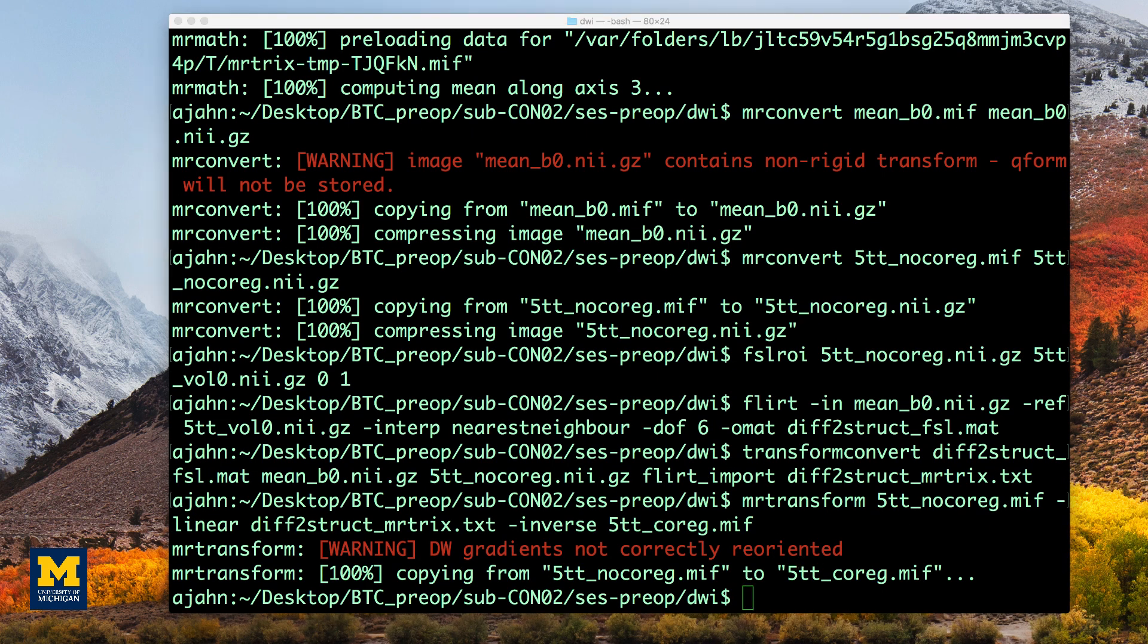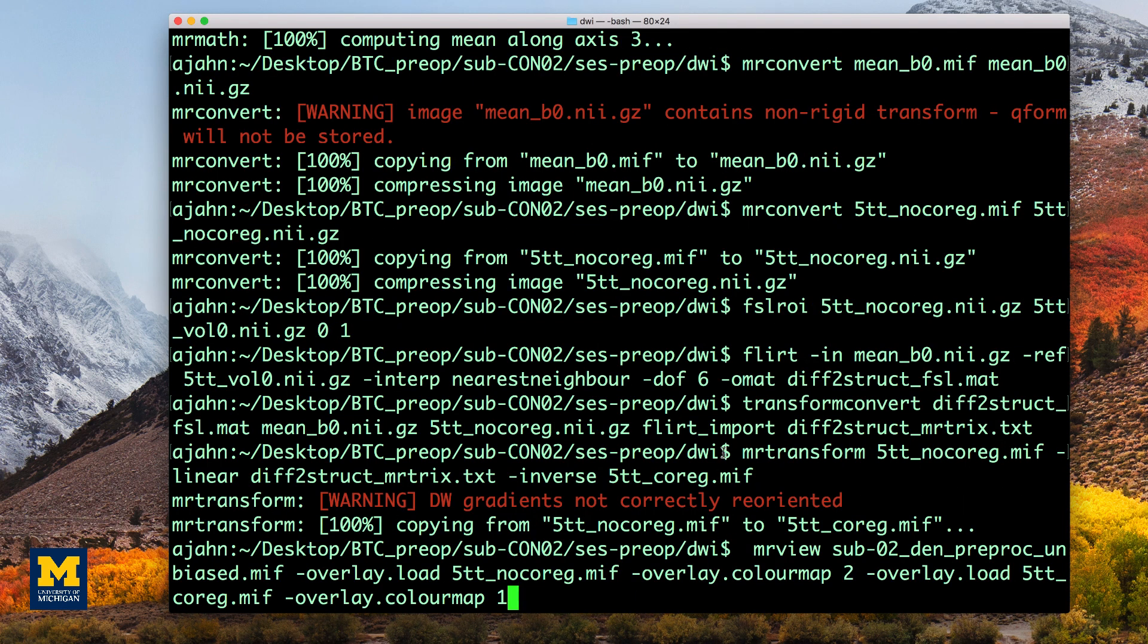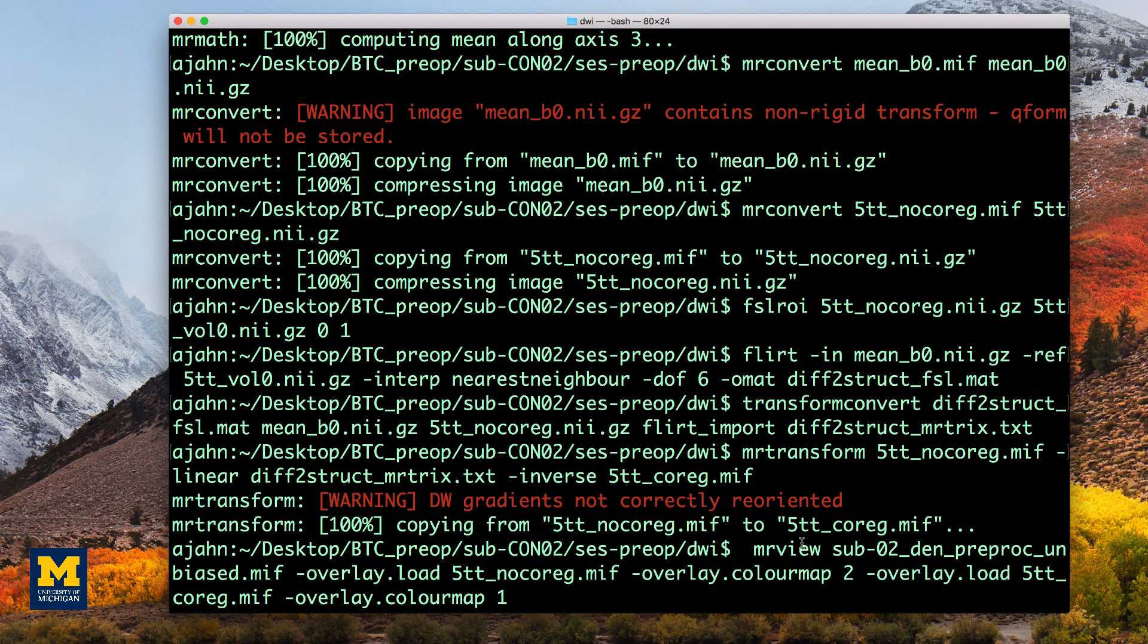This file can then be loaded into mrview in order to examine the quality of the co-registration. The overlay colormap options specify different color codes for each image that is loaded. In this case, the boundaries before co-registration will be depicted in blue, symbolized by the number 2.